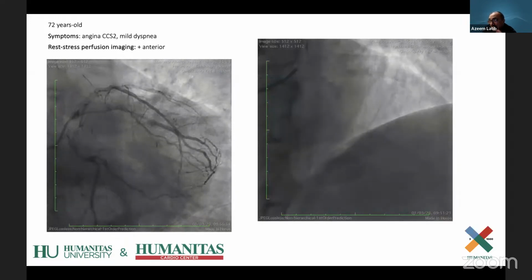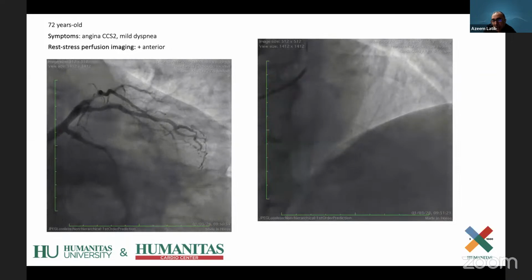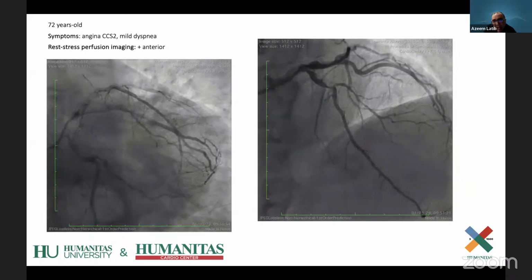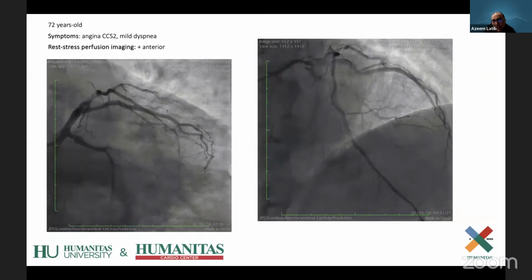If you just put the stent in after the non-compliant balloon, I think your MSA would have been acceptable. Yeah. But I don't think your stent expansion would be as circular as it was in that final picture, right? Yeah.